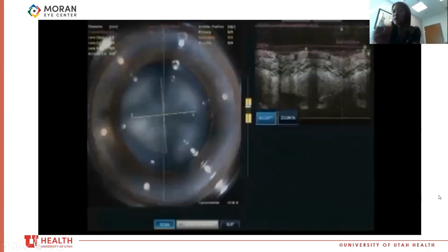So this was a while ago. The story is this was a young guy who had a history of blunt trauma, had a white cataract on exam, shallow anterior chamber, very intumescent white cataract. His pressure was up. I had him controlled with a couple drops. May have had him on Diamox briefly, but took him to the OR, and I thought, well, there are different ways to address an intumescent white cataract.